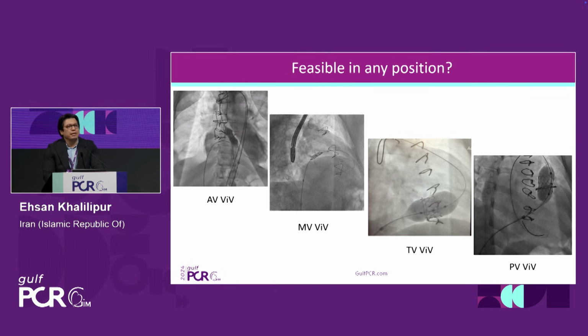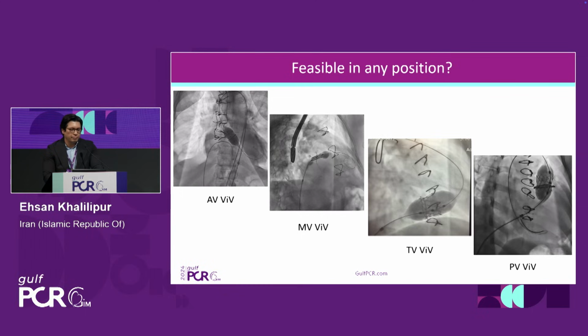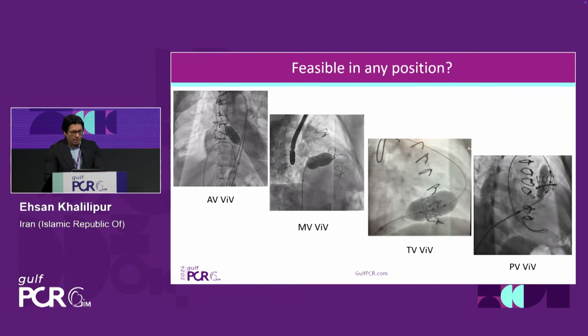Is it feasible in any position? Yes, it is really feasible. This is the summary of all positions: aortic, mitral valve-in-valve, TV, and pulmonary.